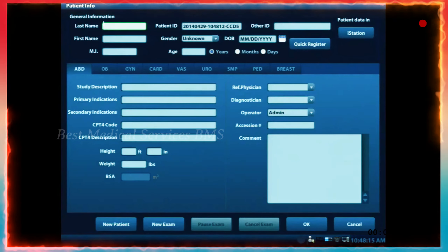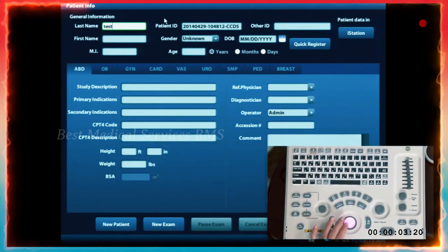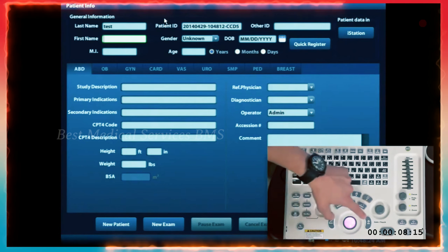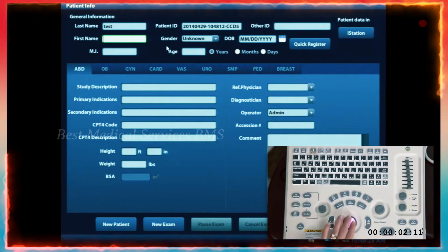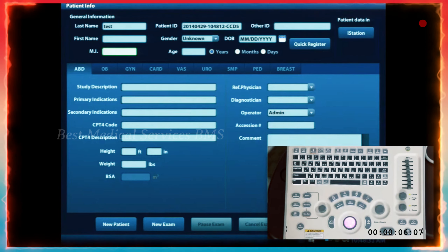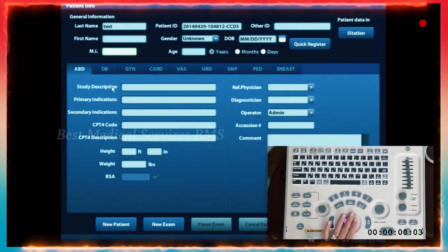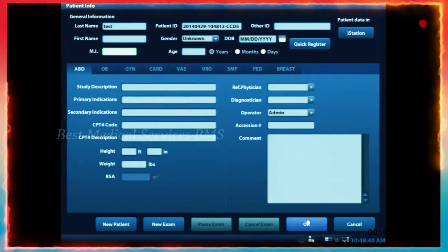When you pull up the patient information screen, you're able to use the cursor and type in whatever you want. You can use the tab key to go between fields, or use the trackball and the set key to click into one field. Some people like the tab button, some people like the trackball and set key. From there, use the trackball to scroll down to okay at the bottom of the screen and hit the set key.